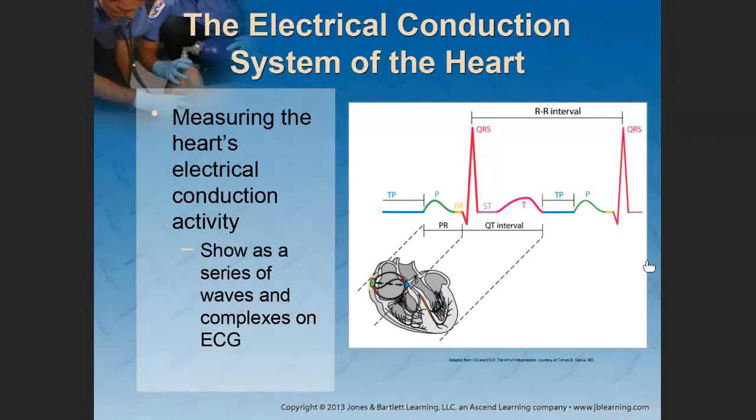All right, so what we're going to look at this afternoon is the basics of ECG and cardiac monitoring. I've already touched on cardiac monitoring to some extent as it relates to the purpose, how many electrodes you're using, and what exactly you're looking at.